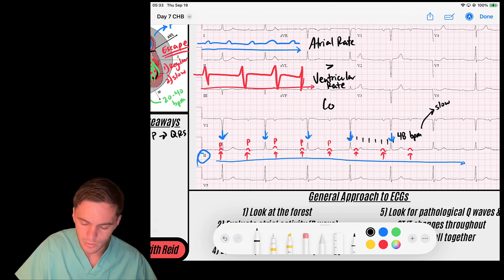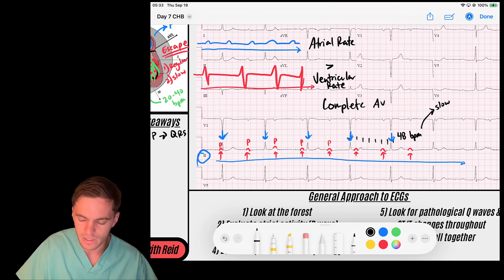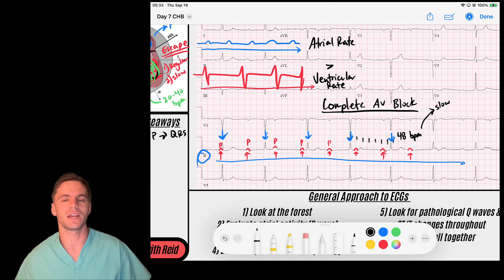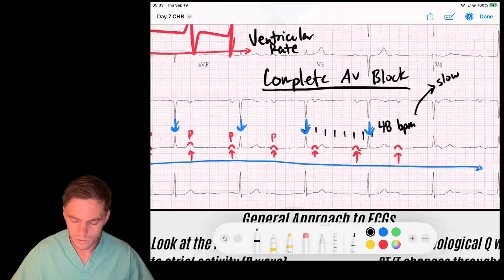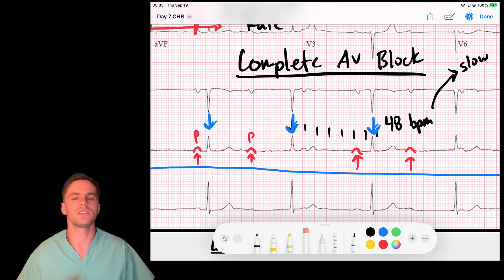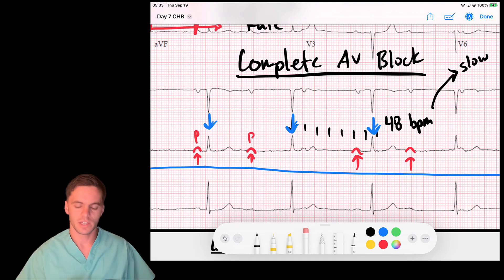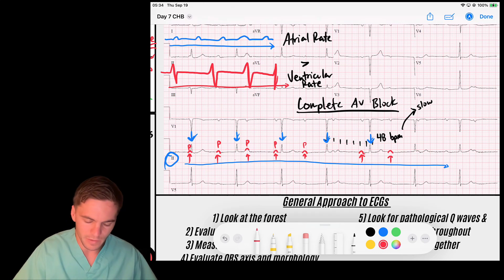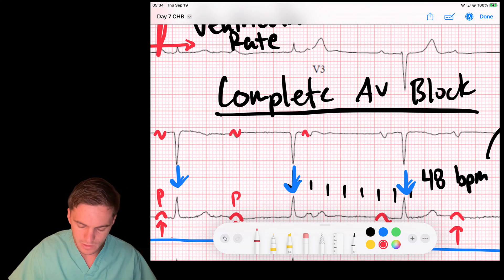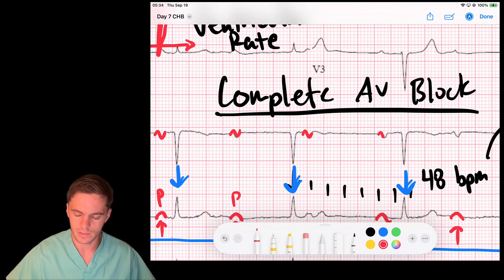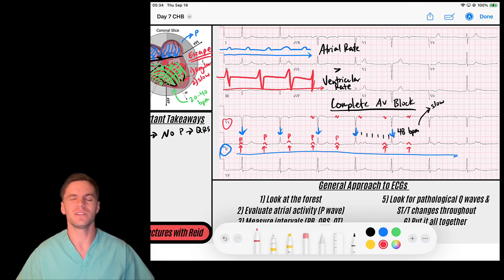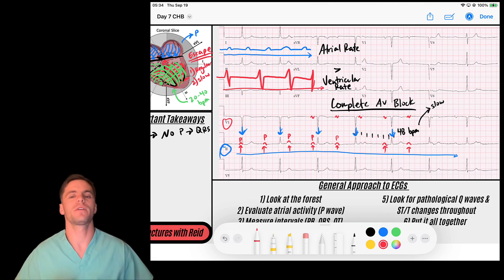This is a really good example of a complete AV block. You might ask how we know P waves are buried in the ST segments. Remember that P waves are usually sharp deflections while T waves are broad deflections — use those context clues. Also look at lead V1: you can see nice sharp biphasic P waves, and you can see a sharp biphasic P wave occurring right on the ST segment after the QRS complex, then here and here. Other leads can help you better comprehend atrial activity, and you'll develop an eye for it over time.